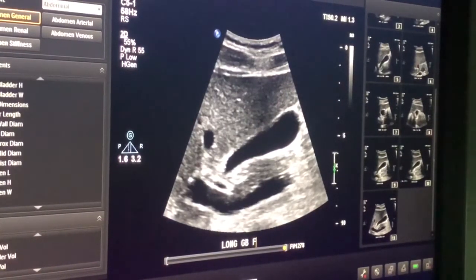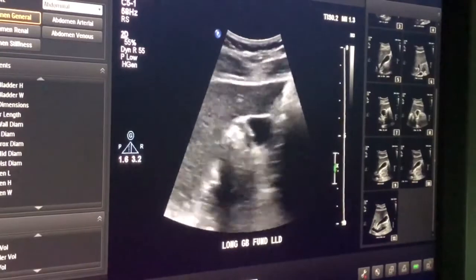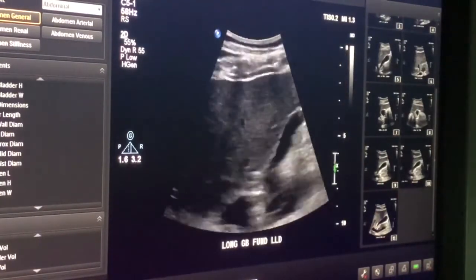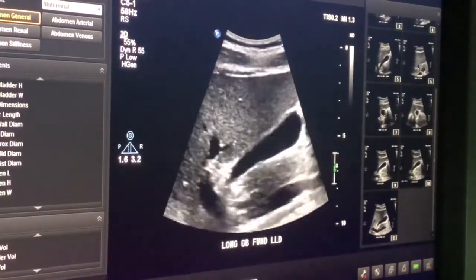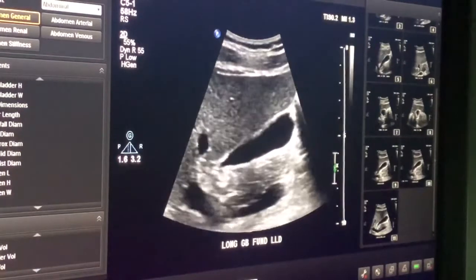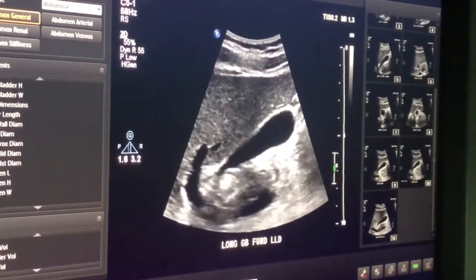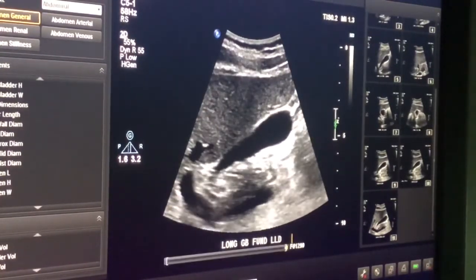Now I'm going to take a picture focusing on the fundus. And have the patient take a deep breath in again. And you could tell before I was being cautious about my probe orientation. Sometimes you have to adjust when they turn to decubitus. It can change the way you have to angle your transducer to be in a true long or a true trans axis. Okay, breathe, patient.